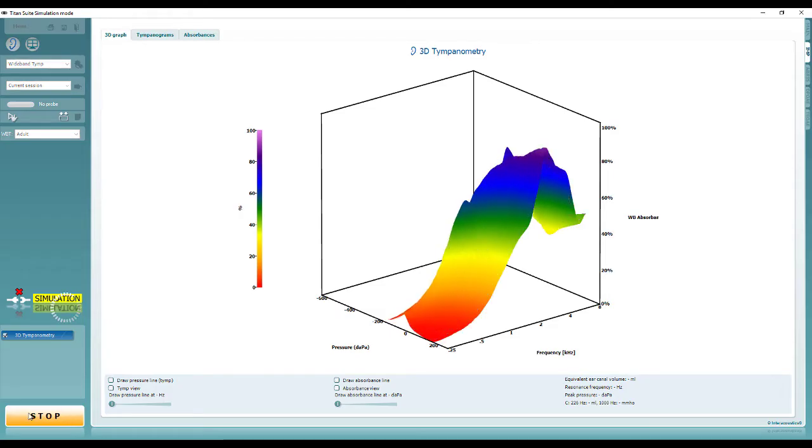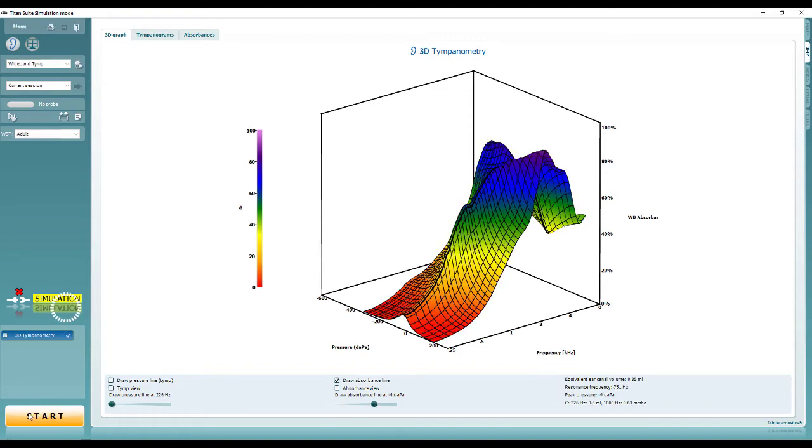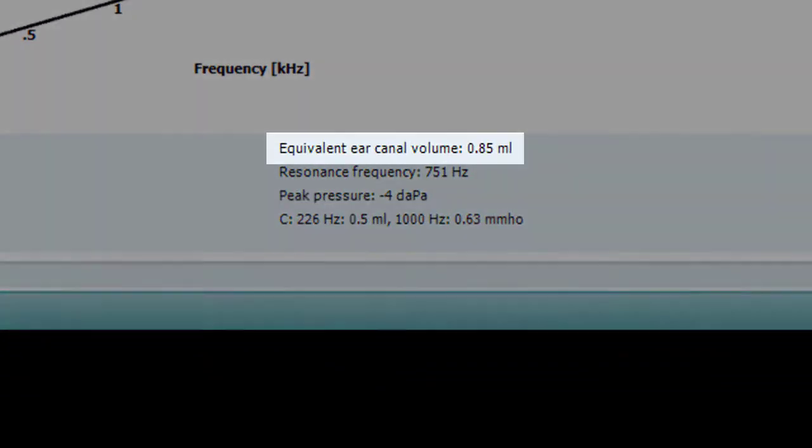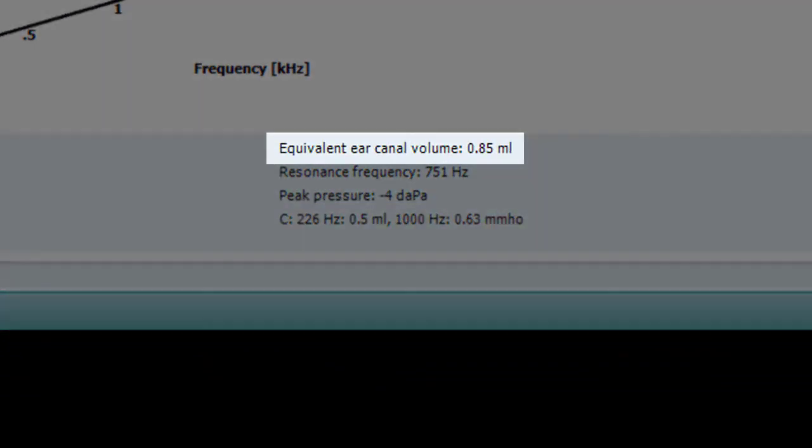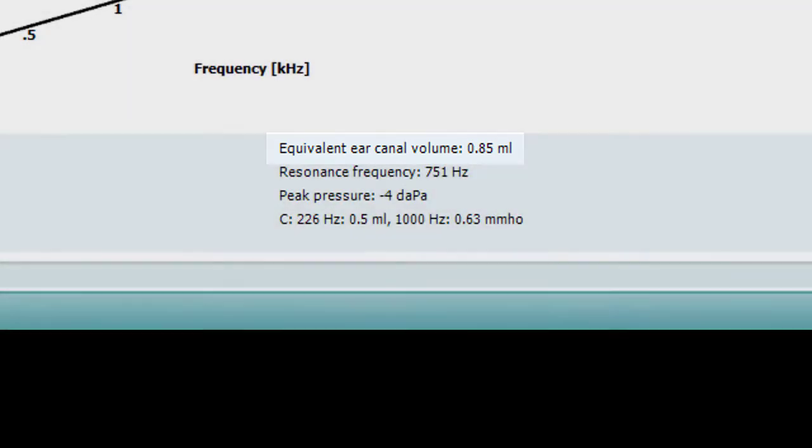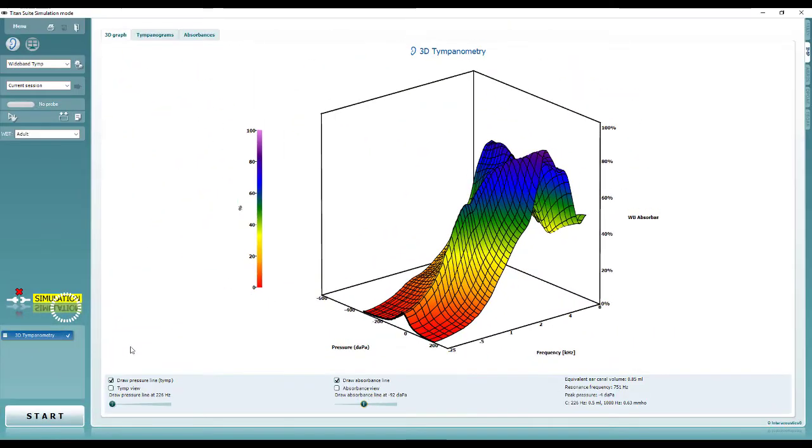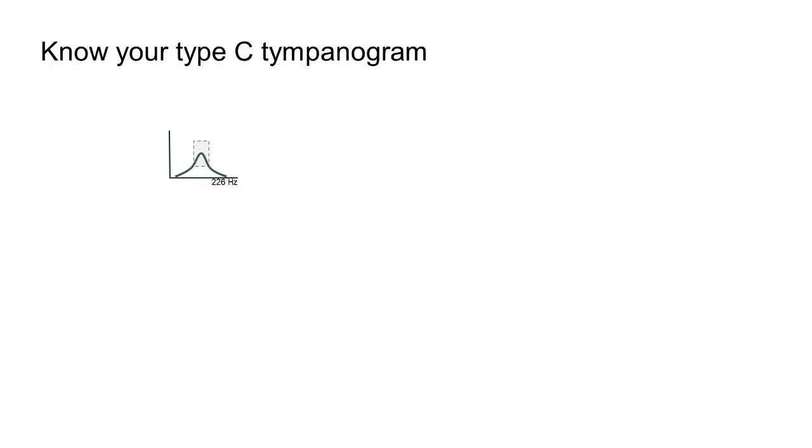First of all, we want to ensure we are inspecting a tympanogram with a normal ear canal volume to rule out any other pathology such as a perforation. Then, we can consider our single frequency tympanogram. In the first example, we can see an example of a normal tympanogram, often described as type A.